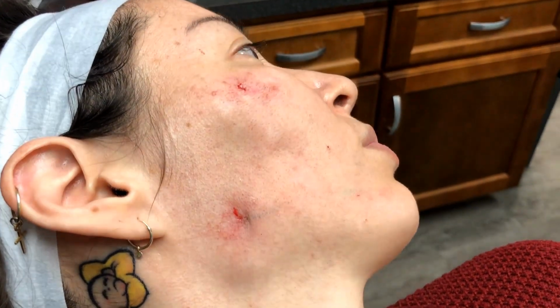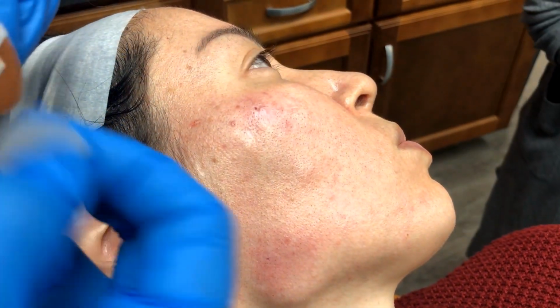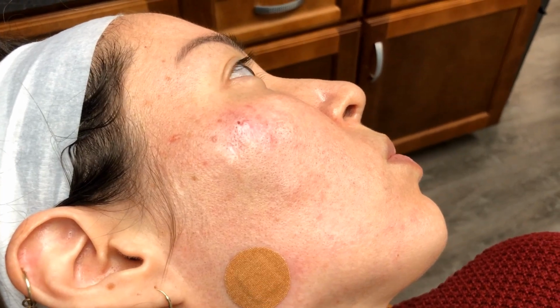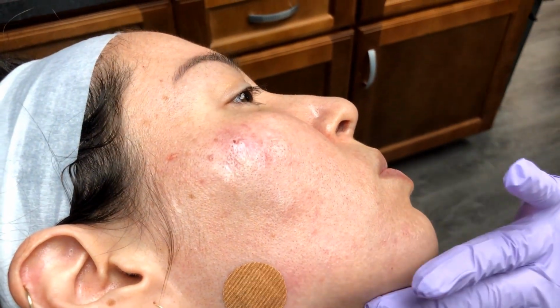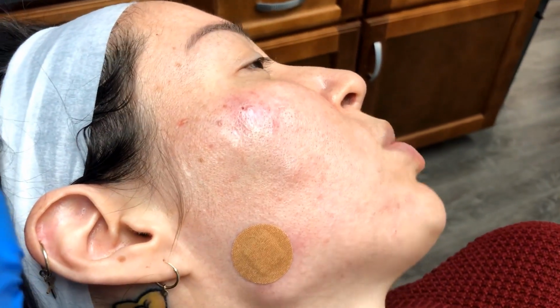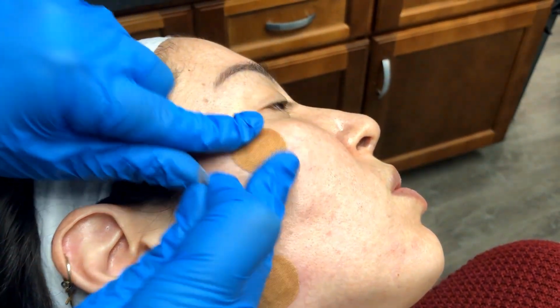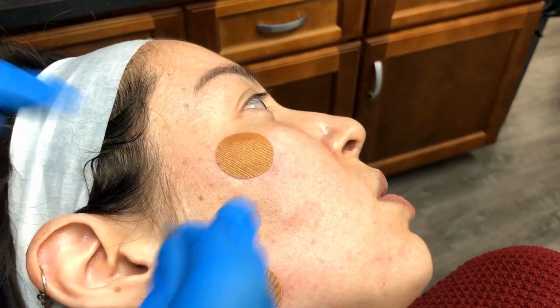Now clip those threads, go ahead and clean them up, put some band-aids on there. They do get post-op instructions, which are important as well. And make sure that you learn how to deliver this for your patients properly with the FDA cleared class 2 threads to protect your license and your patients.